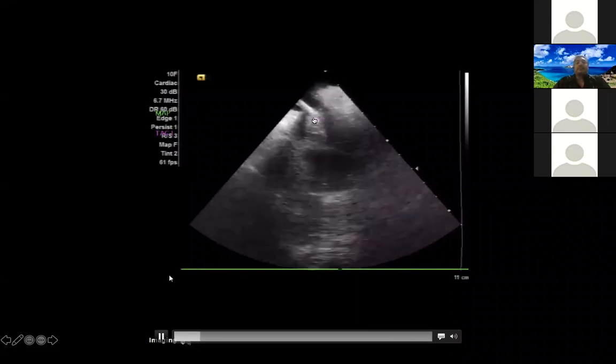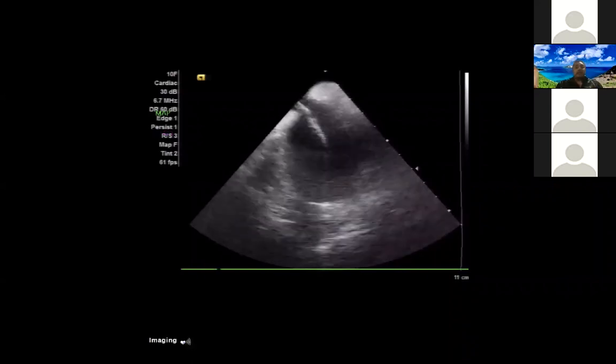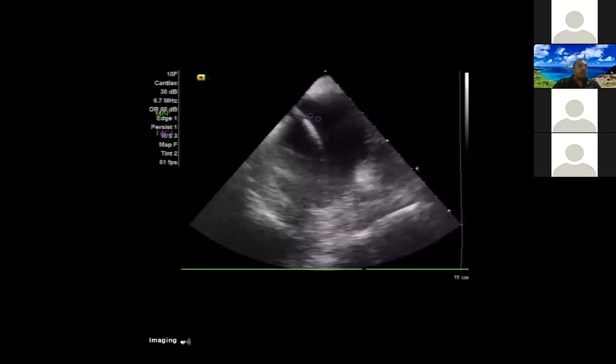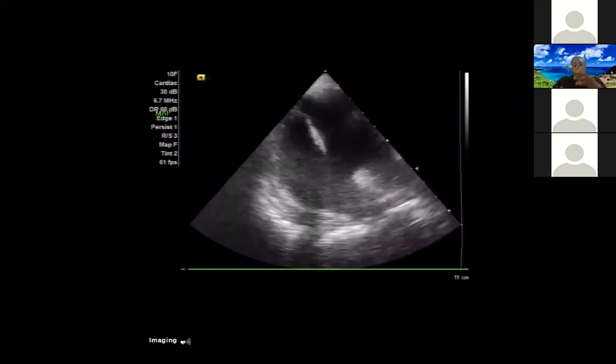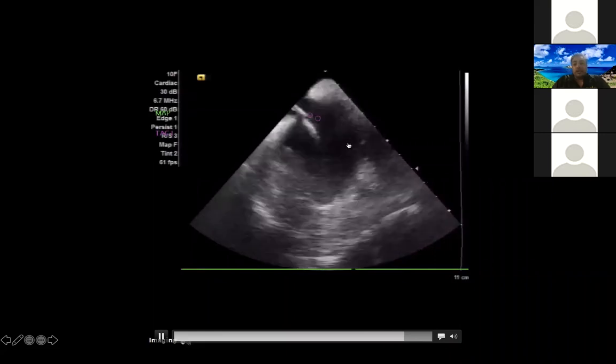I used to get so upset if I lost my transseptal in a case, but now it doesn't happen that often, and if it does happen, it's really not a big deal. Almost always, if you've marked where you crossed, either by FAMing it, you can pull it back and get an anatomy of where you crossed, or you have a contour.